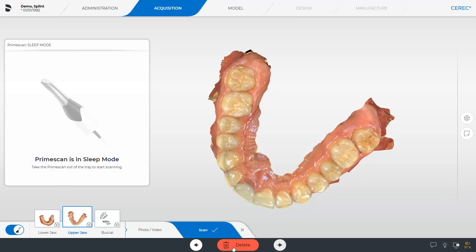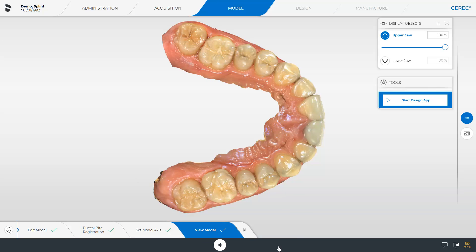To create a splint, three image catalogs are scanned. Next we move on to the next phase, the model phase.